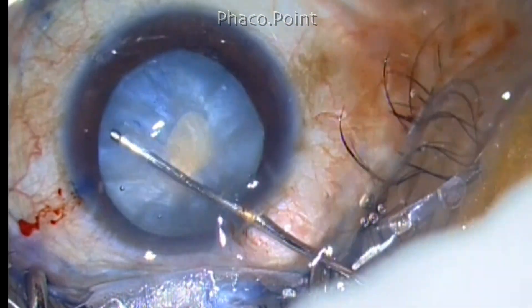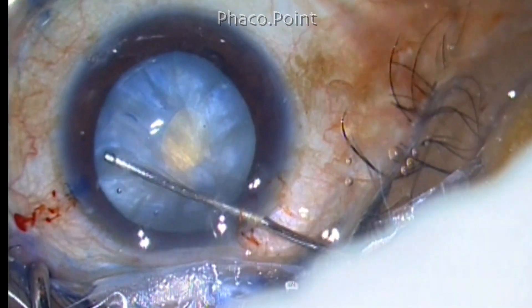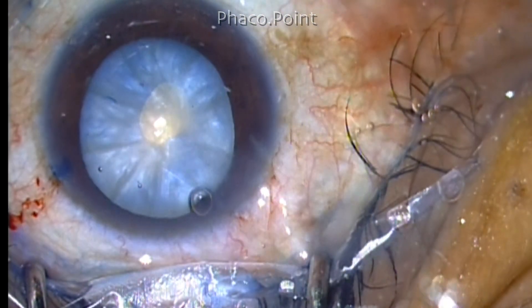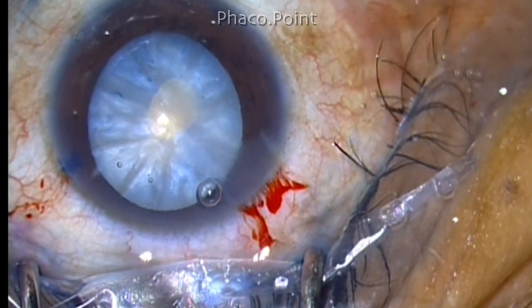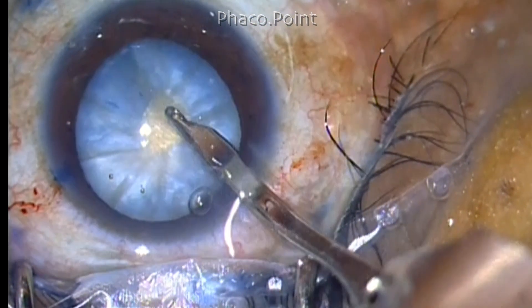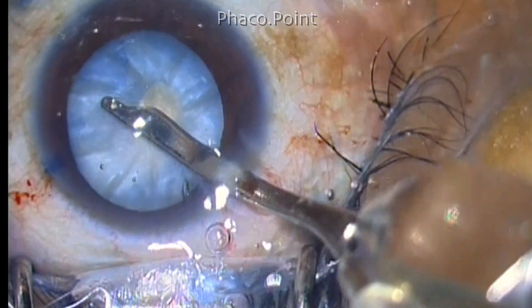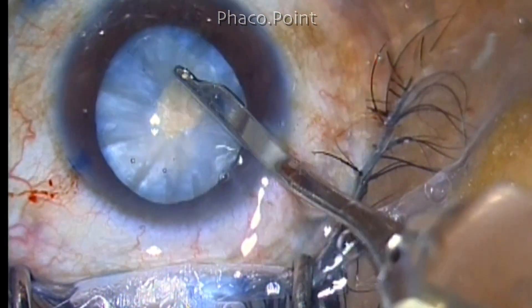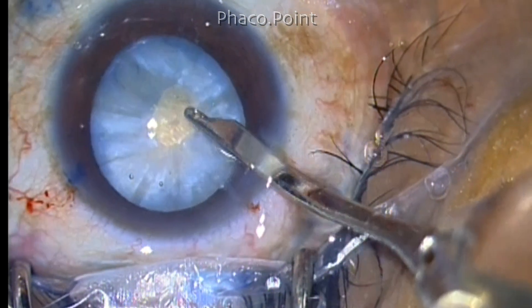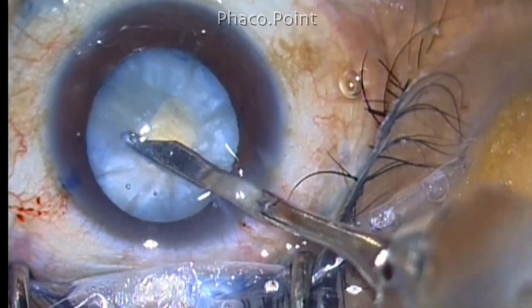The decompression of the lens is then carried out by just flushing out the liquefied cortex with simple irrigation using a 27-gauge cannula. In this case I'm also aspirating a little amount of liquefied or loose cortex with the help of a Simcoe cannula, which is a 23-gauge Simcoe cannula. Now once we have aspirated sufficient amount of cortex, the intumescence no longer exists and the positive intralenticular pressure also ceases to exist. While trying to clear up the cortex, make sure you press down the center of the lens in order to decompress the posterior compartment as well.